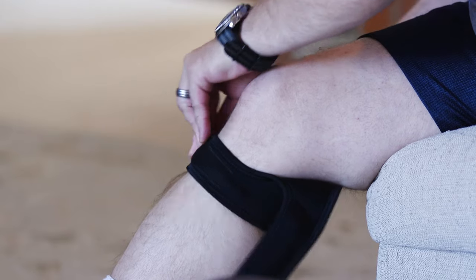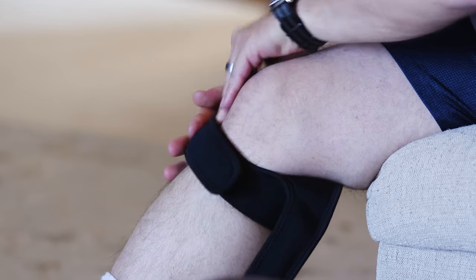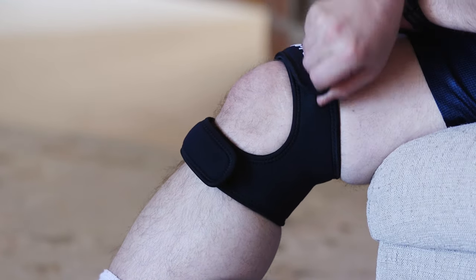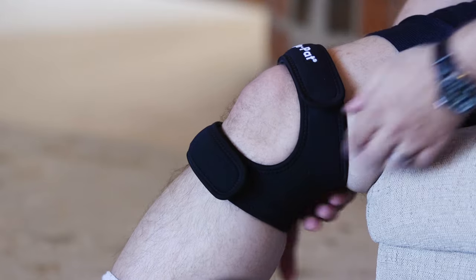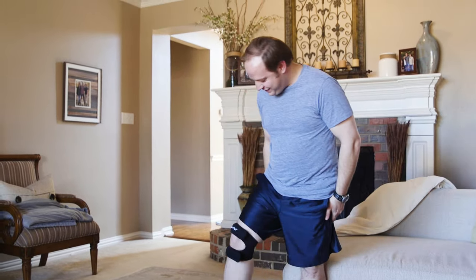The Dual Action Knee Strap applies pressure on the patellar tendon below the kneecap to stabilize and tighten the kneecap mechanism, which improves patellar tracking. The strap also applies pressure on the tendon above the kneecap, reducing the pressure being forced on the knees by the quadriceps.